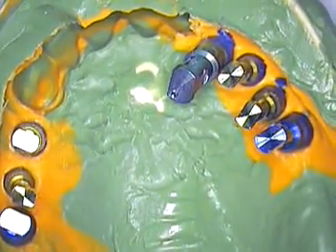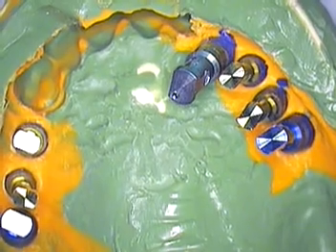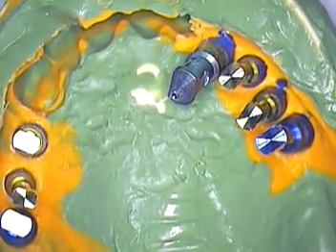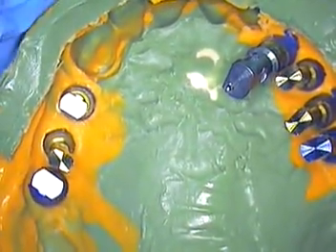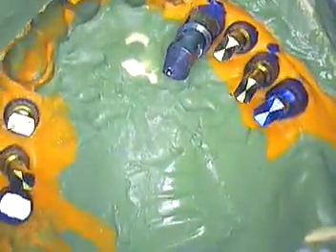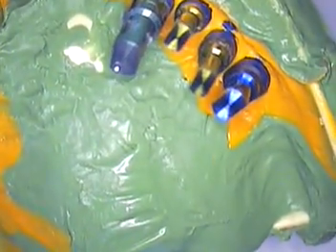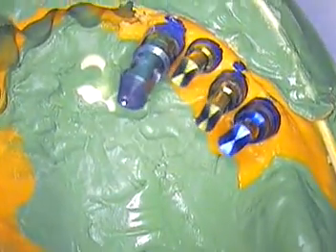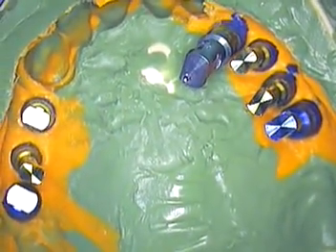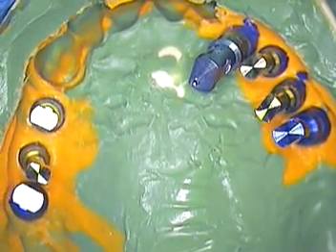In the previous video, we showed you what we did in the mouth as well. We wanted to lute the impression copings together in the mouth prior to taking the open tray impression. If we need to, we'll join these together and do a second pour. But I want to go ahead and show you the laboratory and diagnostic wax up as well as model pouring and model fabrication.